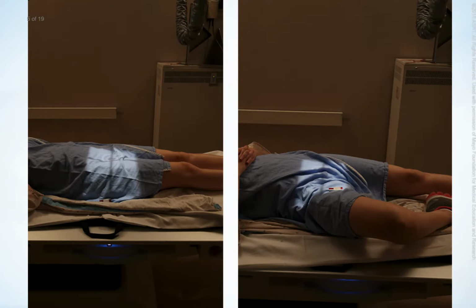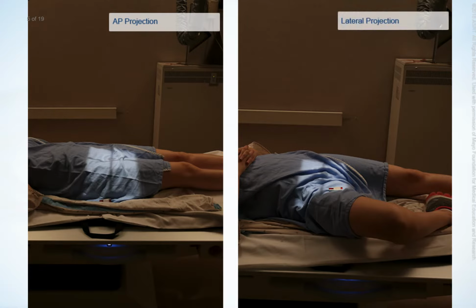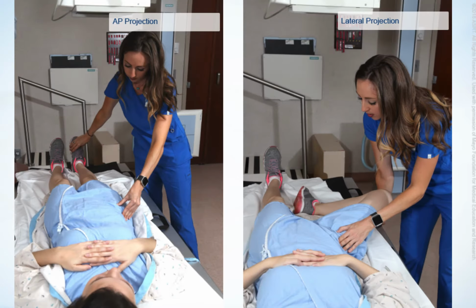The hip is generally examined using unilateral AP and lateral projections, although an AP projection of the entire pelvis and proximal femora is sometimes performed in the initial evaluation of a hip lesion. Standard positioning for hip examinations involves manipulation of the lower limb, which may be contraindicated in patients who have traumatic injuries or certain pathologic conditions.